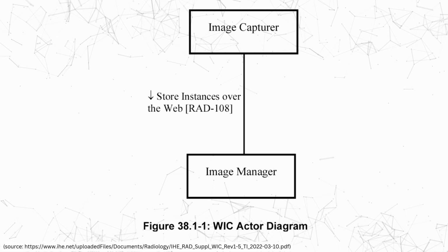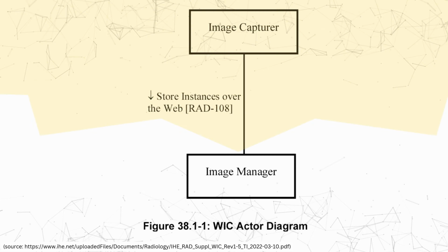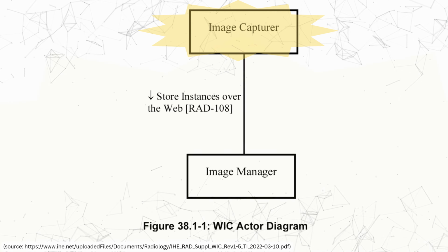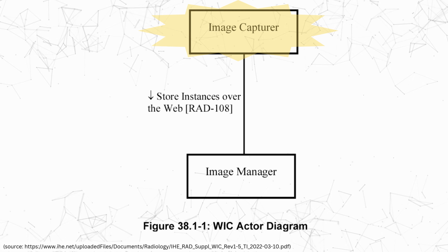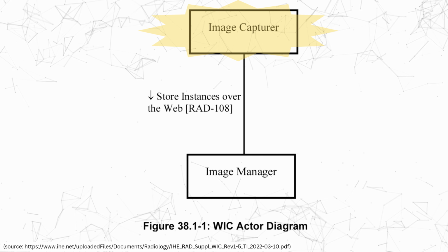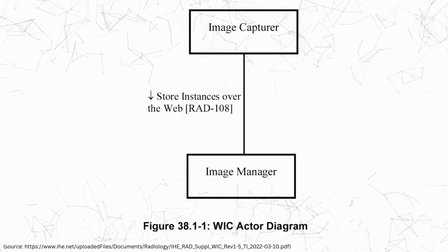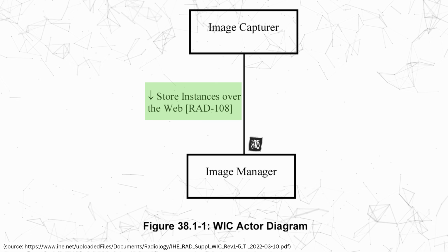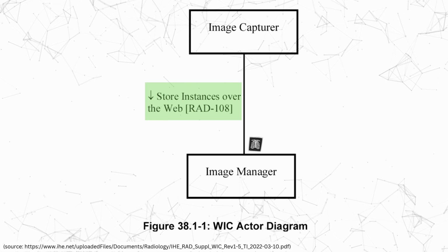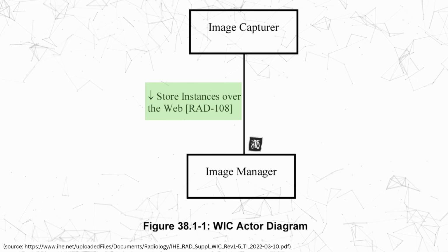The WIC profile contains two actors, the Image Capturer actor and the Image Manager. The Image Capturer can take imaging files like JPEGs or PNGs or raw DICOM or other content and then send that using DICOMweb STOW to an Image Manager.